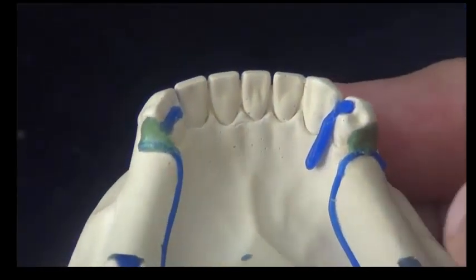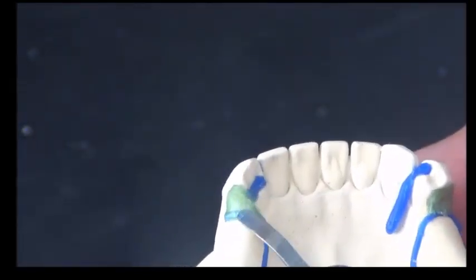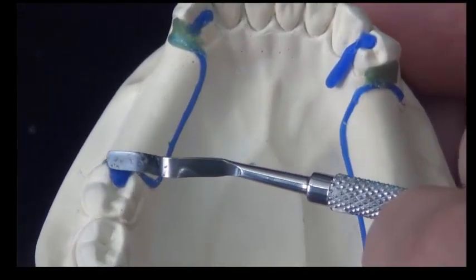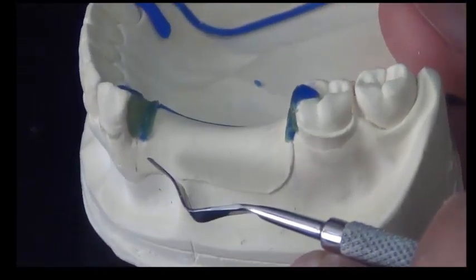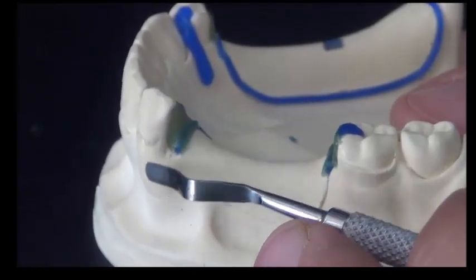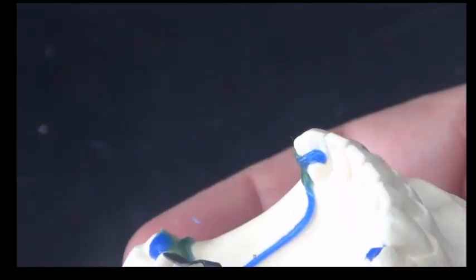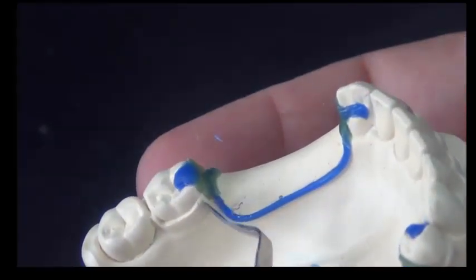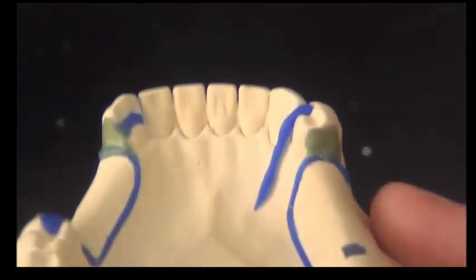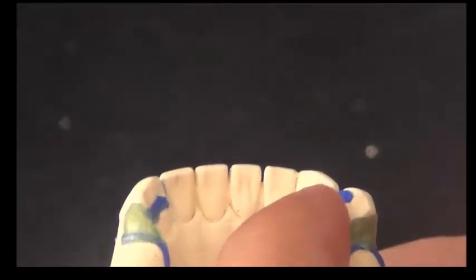This is the lower. It has the same features. You can notice that the rest is connected to the guide plate. This rest is connected to the guide plate with enough thickness, sufficient thickness. Here it's connected to the guide plate. Here also is connected to the guide plate. The guide plate does not exceed the buccal surface. This line angle does not exceed it. Lingual also doesn't exceed the lingual angle. And you have smooth surfaces between structures. And the lower minor connector goes down in the embrasure, fills in the embrasure.